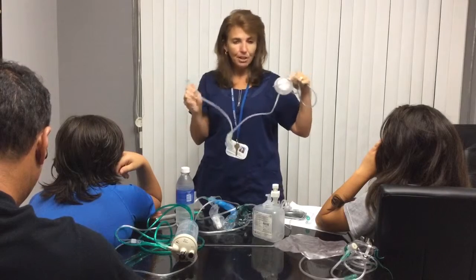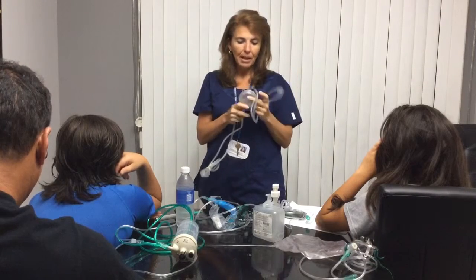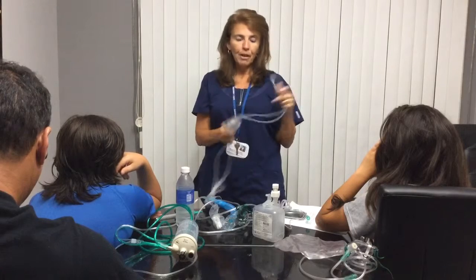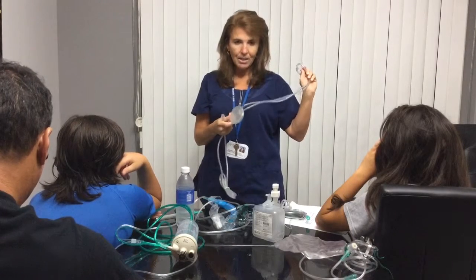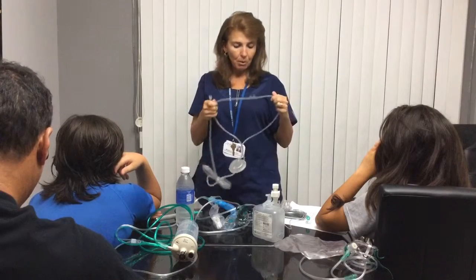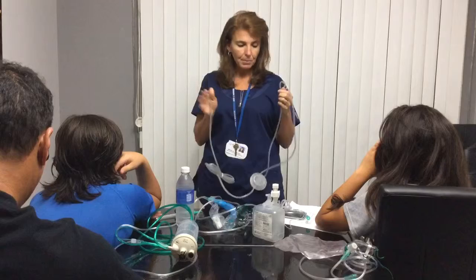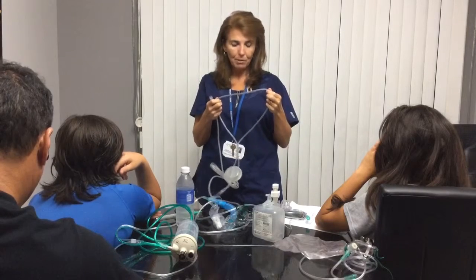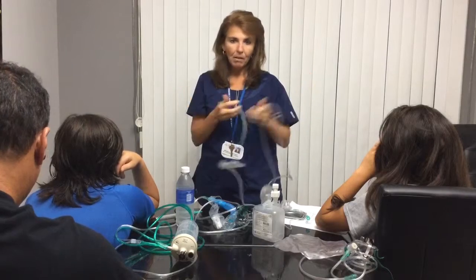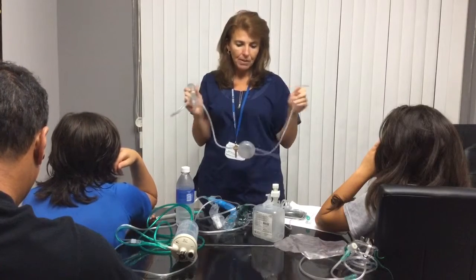This type is never humidified because unfortunately, if the diaphragm in here, a little membrane, would get wet, it wouldn't function, and it could actually cause obstruction for the patient. The patient wouldn't get any flow at all. So very important, even though it's high flow, this particular device does not require humidity. And 6 to 15 liters as well, and you can transport patients on this type of device.